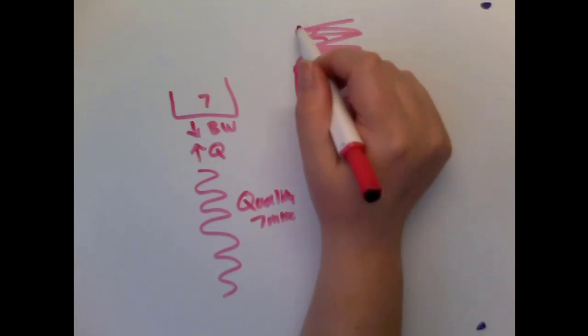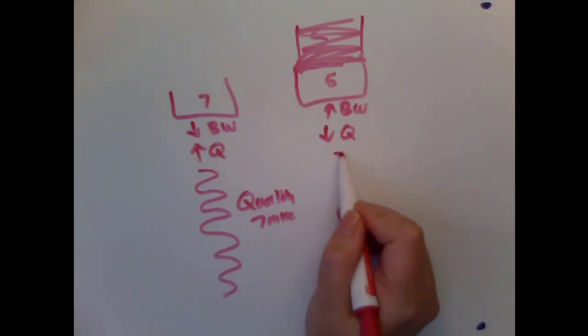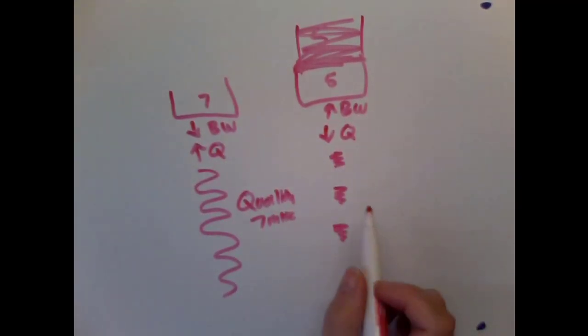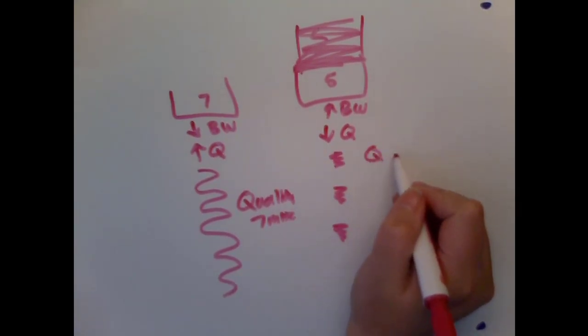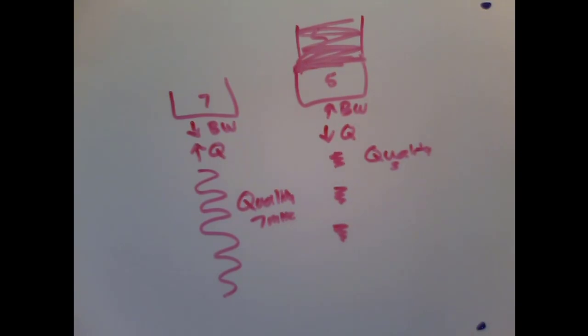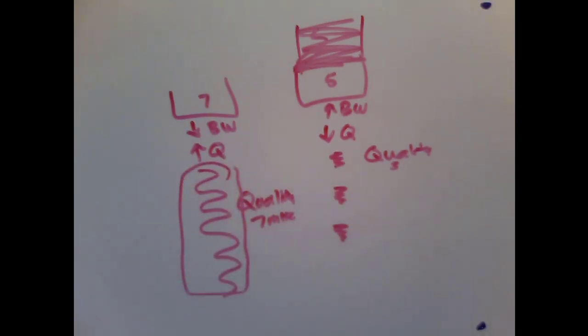Our 5 megahertz transducer with the backing material, remember we're going to get those little chirps that come out? These are going to be very low quality 5 megahertz waves because it has everything from 2 megahertz up to 8 megahertz in it. So that quality factor tells us how pure is the wave coming out of it, not how good the picture is.